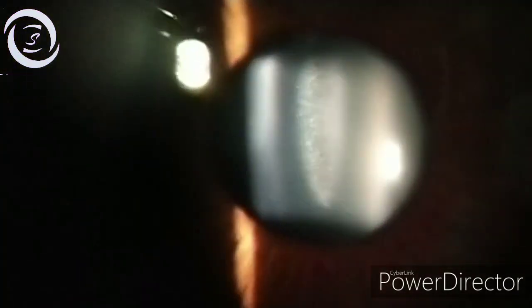We performed slit lamp examination and found this central opacity in the lens and diagnosed him as a case of blue dot congenital cataracts in both eyes. Now in this video we are also explaining how to perform one of the most important slit lamp examination techniques.